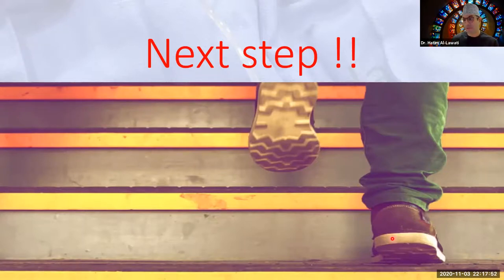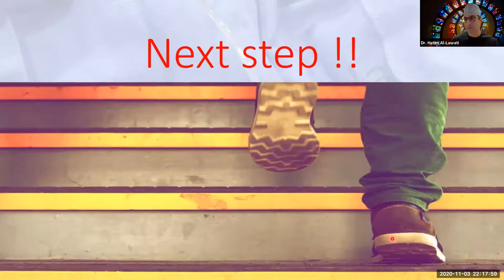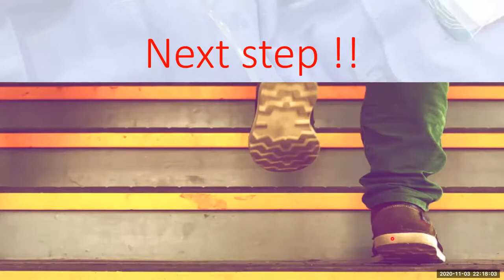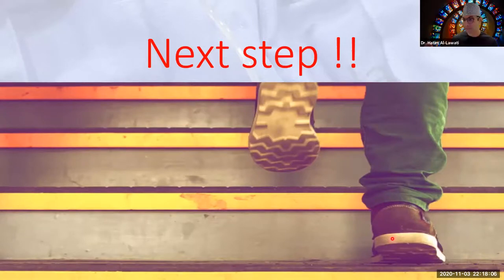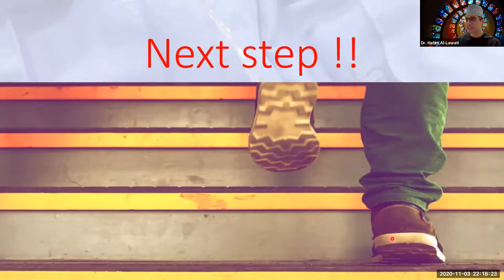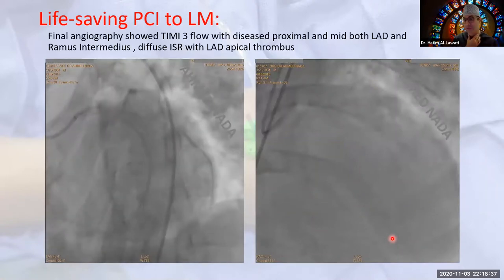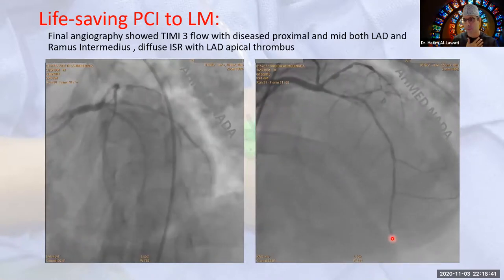To be very honest, now that you've restored flow into the left coronary system and secured the main vessel, your patient is now hemodynamically stable. I would actually consider stopping here, aggressively treating the patient with heparin and perhaps even glycoprotein 2B3A inhibitors, and relook him in 48 hours. Perfect. Dr. Mansour. The entire LAD is diseased and full of thrombus, and additional manipulation there could compromise the flow that you've achieved, with further embolization and slower flow in the LAD, and might make the situation worse. So that would be my approach here.